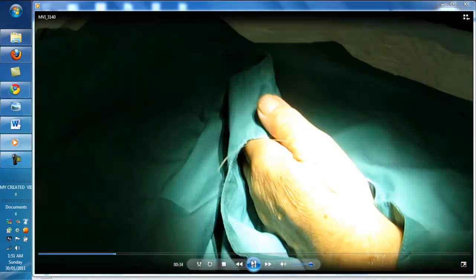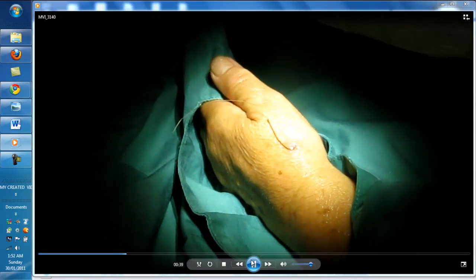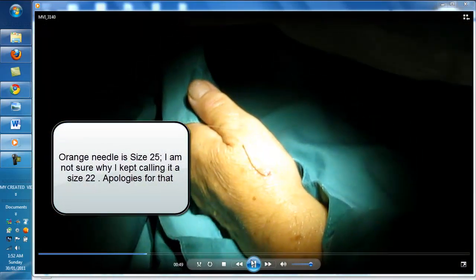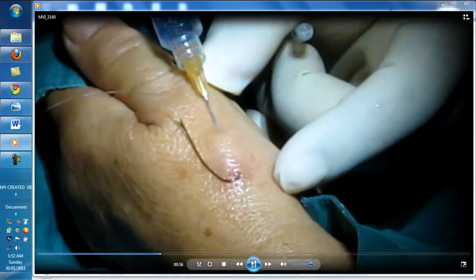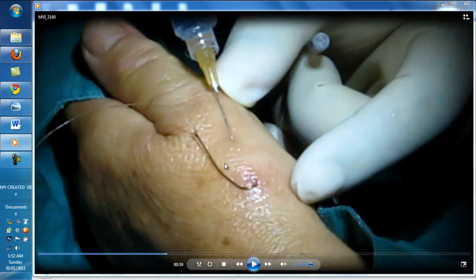All the way. And size 22 — the orange needle, please. Thank you. So this is a size 22 orange. A little sting for you, okay, sorry for that. So raise a bleb where you are going to push and extrude the distal point or the barb of the hook.